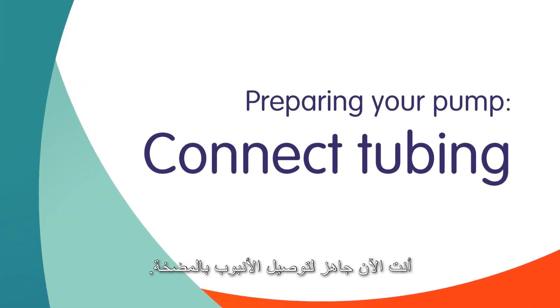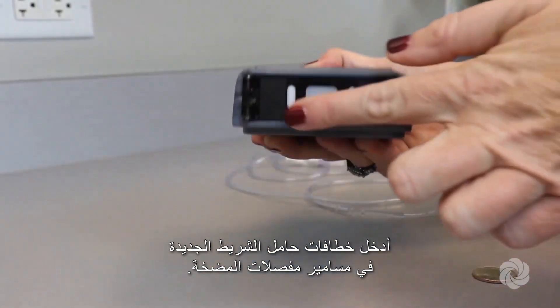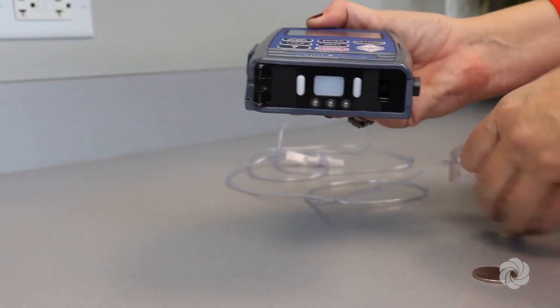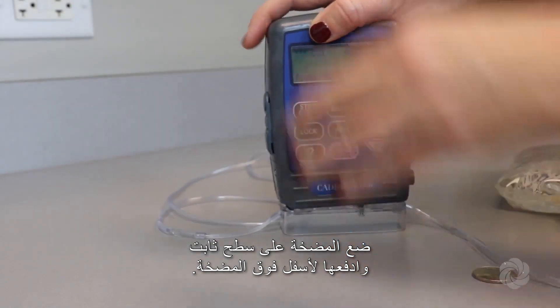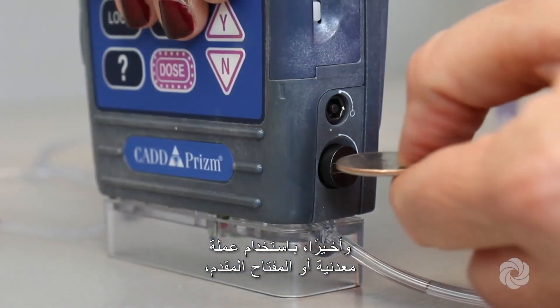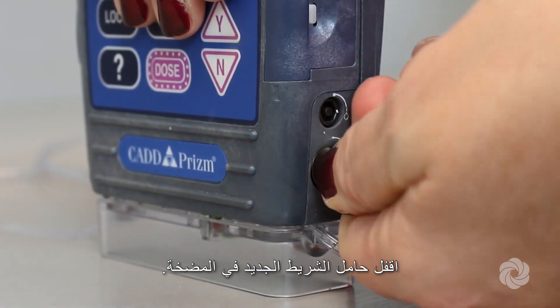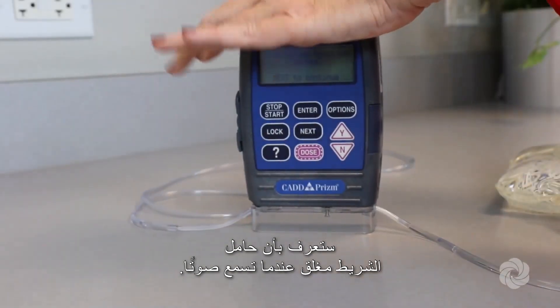You are now ready to connect the tubing to the pump. Insert the new cassette hooks into the pump's hinge pins. Place the pump on a firm surface and push down on top of the pump. Finally, using a coin or the key provided, lock the new cassette to the pump. You will know the cassette is locked when you hear a beep.